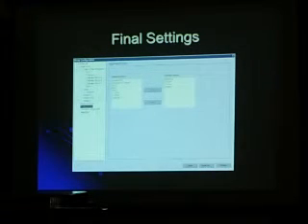Your final settings on our system, we pick what we call protocols, which basically declare what kind of measurements you want, because you can see it, we have our log, and then it says the S1, S2, S3, S4, and then you can drop measurements in there. You can program that individually to each one of these different protocols, and then you can select the protocol. So if you're only doing A pacing, you'll see an AH or an H or an AV, and you're measuring it, you'll get that. Then in your V pacing, at that point it's going to be a VA, because it's going backwards. What's your VA intervals, that sort of stuff.